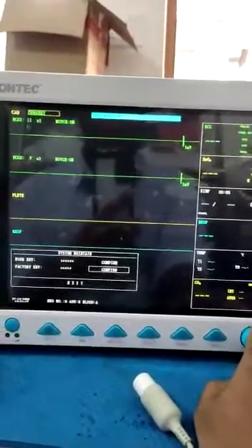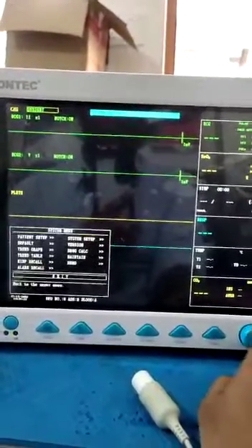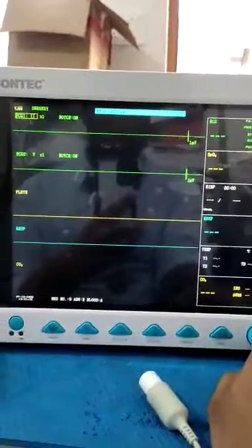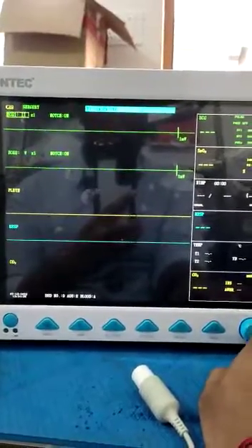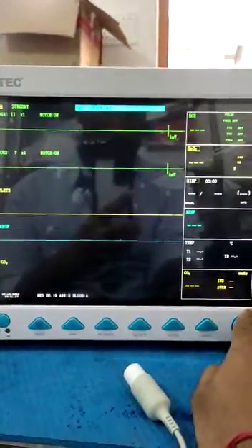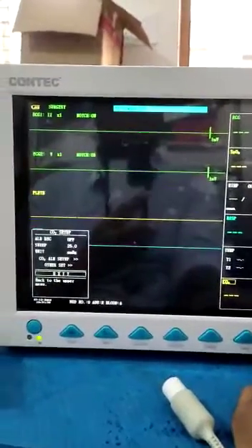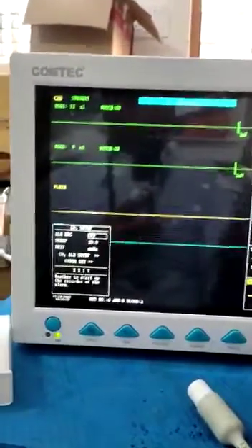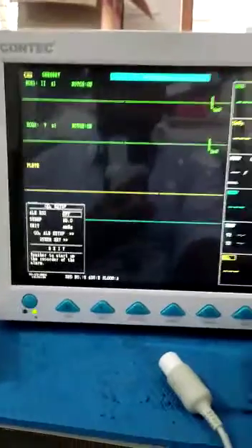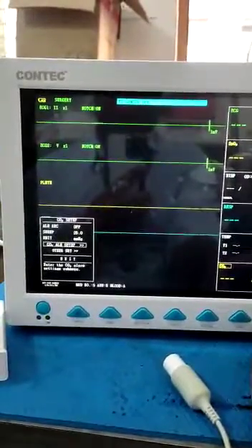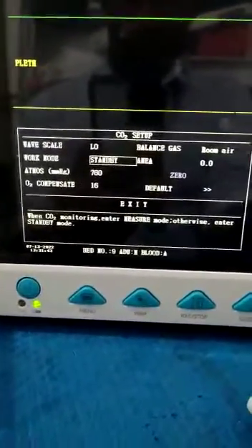Exit the menus repeatedly to go back to the main screen. By default, CO2 was in standby mode. Go to CO2 Configuration, then go to Other Settings. Here you can see the work mode is set to standby — we have to change it to Measurement, then press OK.